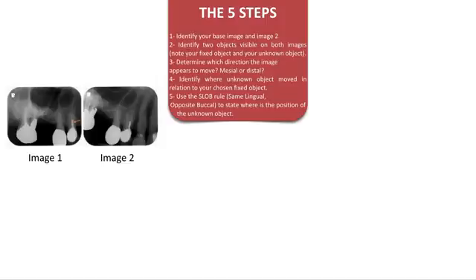Image 2 appears to be moving more mesially because we can see the upper right 3 and 2. And as it happens, the post is moving with the mesial shift. Therefore, using the SLOB rule, same lingual opposite buccal, we can say the post is engaging the palatal root.